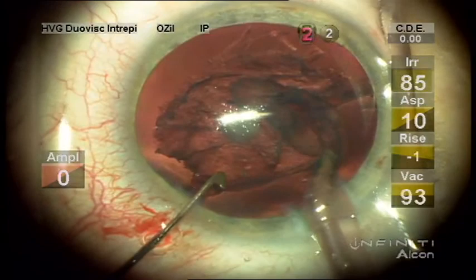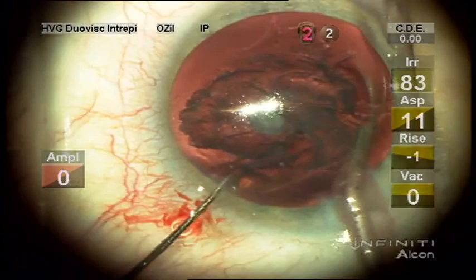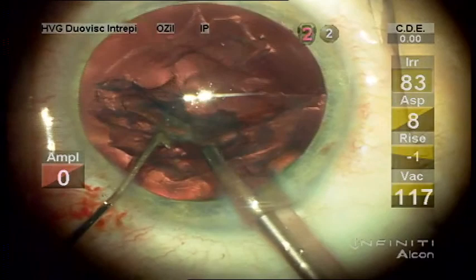So far, no ultrasound at all, just removing lens material with the suction. We should describe the function of the ultrasonic handpiece. It's a process developed by Dr. Charles Kelman back in 1962. Ultrasound is used to break up cataract material. The tip is hollow. It has the ultrasonic function.